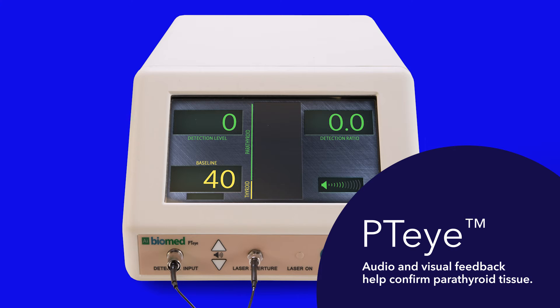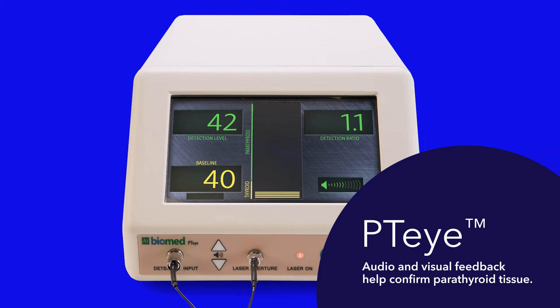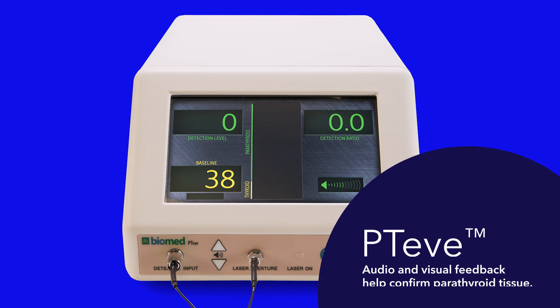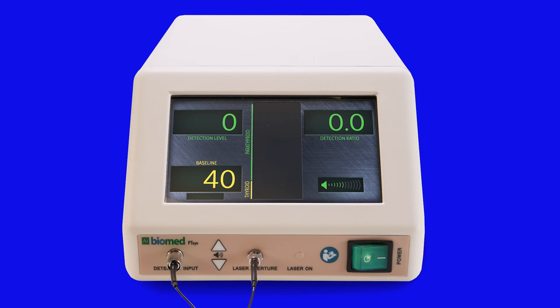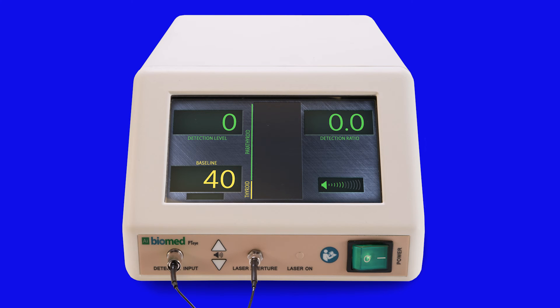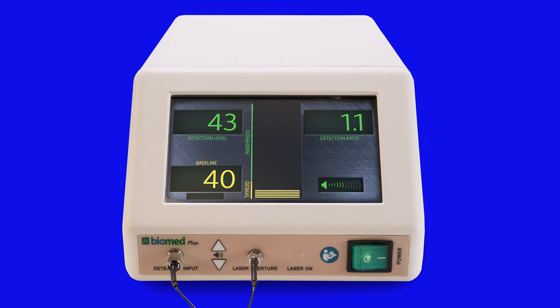When using the PTI system, both the audio and display feedback will assist you in locating the parathyroid. Audio feedback on parathyroid tissue sounds with a slow beep frequency and increases as the detection ratio increases. When using the probe on parathyroid tissue, the display feedback shows primarily green and a high detection ratio greater than or equal to 1.2. When using the probe on non-parathyroid tissue, the display shows mostly yellow and a low detection ratio less than 1.2.